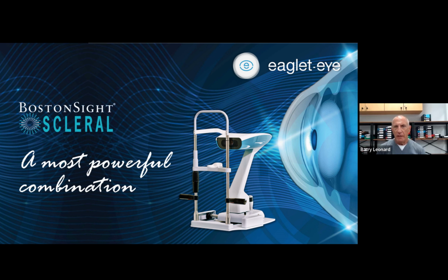So now when we can take profilometry, the first thing, we're going to put a diagnostic lens on their eye, usually to get the power, unless they have something previously, but I don't always trust that if it comes from somewhere else. That first diagnostic lens I know is going to be the correct diagnostic lens. In the past, sometimes you had to put a second or maybe a third one just to get in the ballpark. So right away, you have a better experience for the patient. You get that over-refraction and you're done.